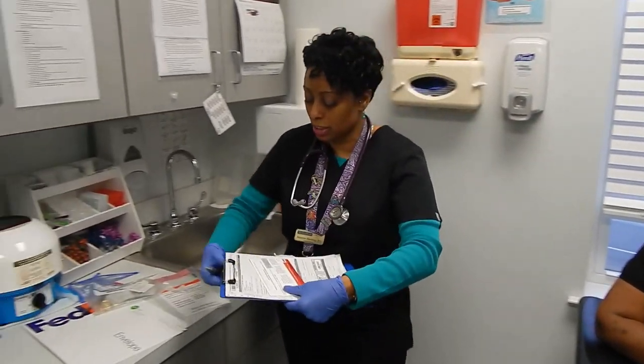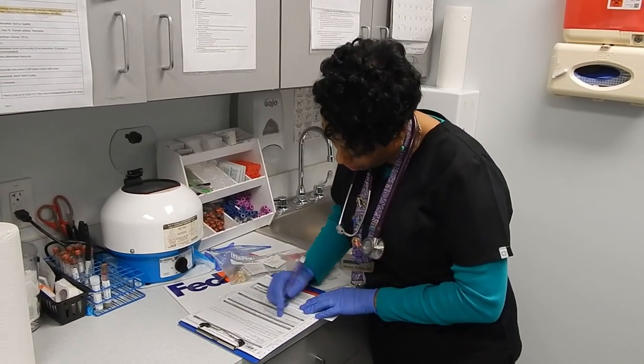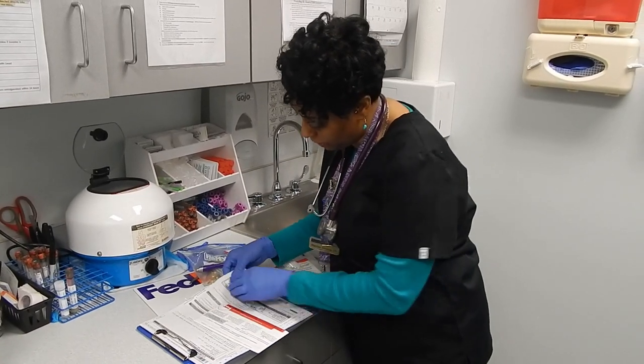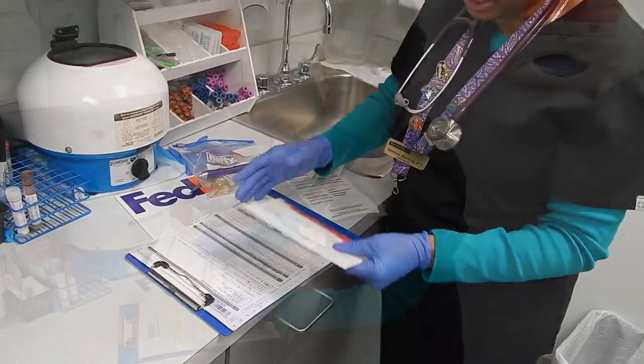And I just need to complete my section. Just a moment, ma'am — when I'm done, I'm going to give you a copy of your test kit. And the last thing I need to do is take the barcode from the chain of custody form and place it on here, so when it gets to the lab, everything coincides.